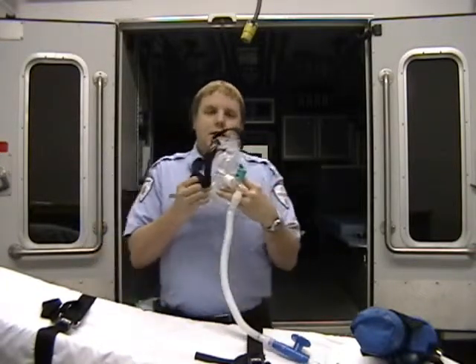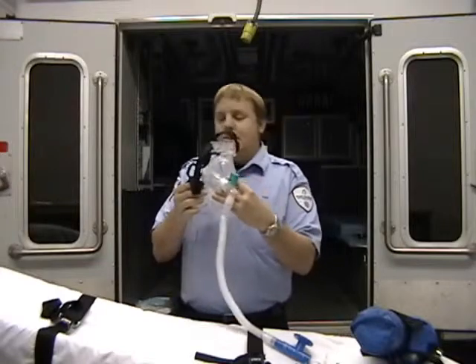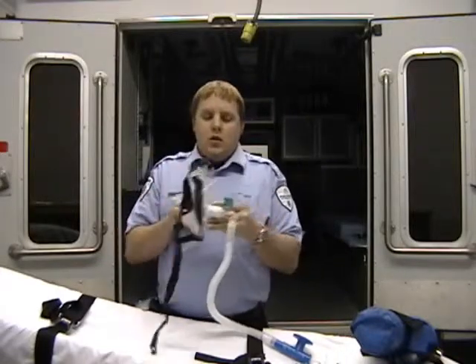Once the mask is secured to the face, you can then tighten the straps down to form a tight seal across the entire opening of the mouth so that no air is escaping. If any air is escaping, you're losing the purpose of CPAP. So it must be very tight, and it actually will look like it is mashing the patient's face.